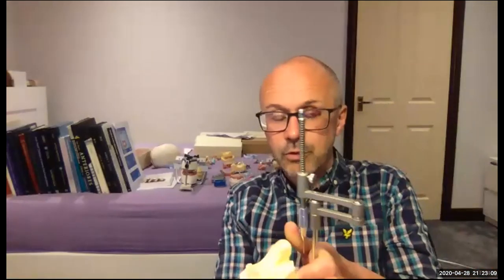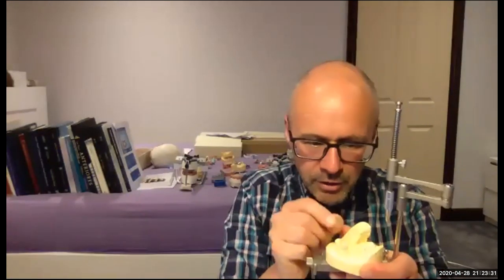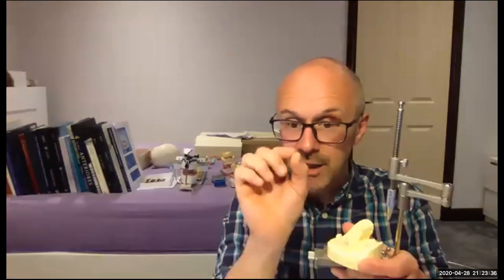Mishari has asked again, do you prepare any of the teeth that are overlaid with the chrome splint in the splint design? I didn't actually do any prep for Wendy. I quite often do, and this is a really good point, everyone. What I use is a little surveyor that I've had for years. It's a little Japanese one. In the lab, we've got a proper big surveyor. We use a surveyor all the time. Me and Rowan get the models on it. Rowan looks at paths of insertion, the best way the denture is going to fit. And then we mark on the model where I want to adjust the teeth. And then I often just use a diamond to cut the teeth a little bit, just to adjust them. But because Mishari, Wendy had such flat back teeth, they were really worn, the whole thing didn't need it. It just didn't need any prep, so that's quite interesting.